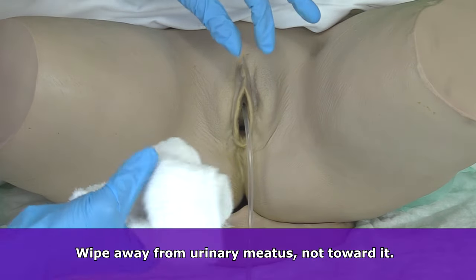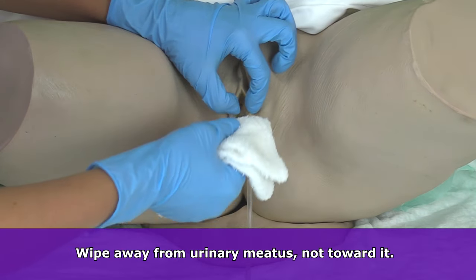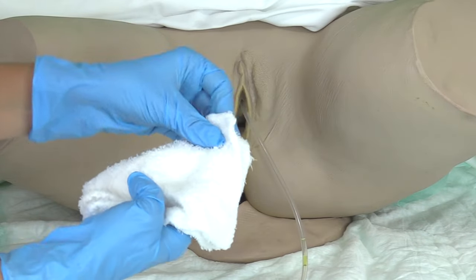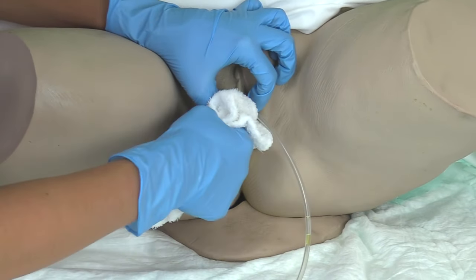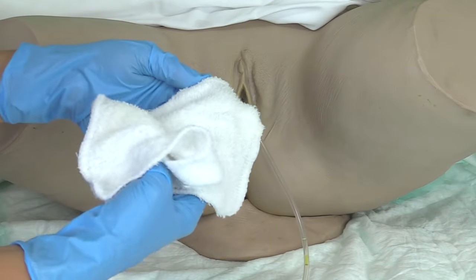So we've warned the patient we're going to spread the labia. We're going to take the first leaf and we're going to go in a circular motion like so. Then we're going to pull back this leaf and we're going to just repeat that again, cleaning those first 2 inches around that area. Now we're going to pull back and we're going to go with our third leaf.